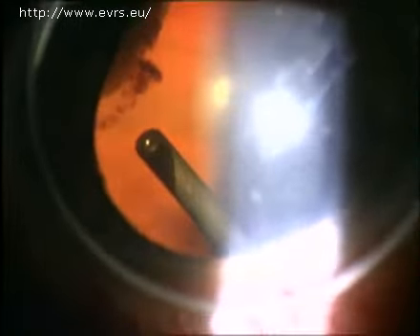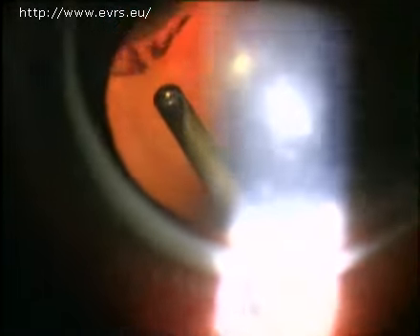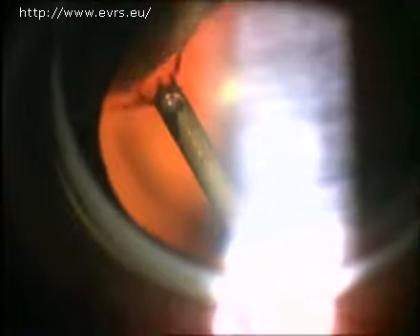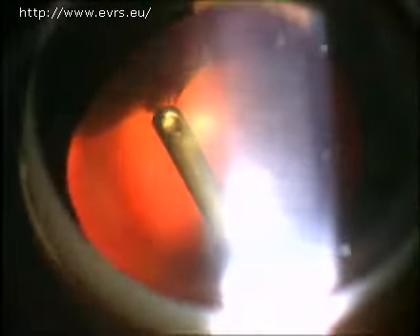We ask for a precise control of the quantity of vitreous that enters the end piece, in order to avoid aspirating or tearing the floating retina to which it is attached. Thus we ask for a precise aspirating flow control. We ask for a quick and efficient cut without pulling out or moving the retina. And finally we ask for a stable intraocular pressure during the entire procedure, and so we want the machine to adapt its infusion flow to the aspiration flow.